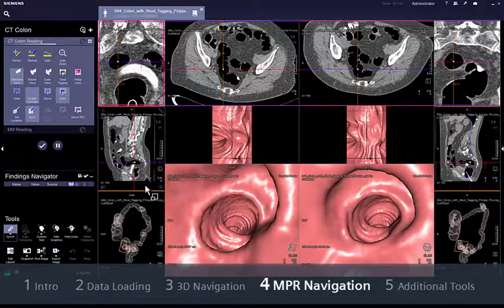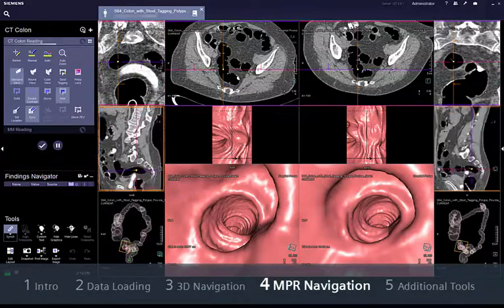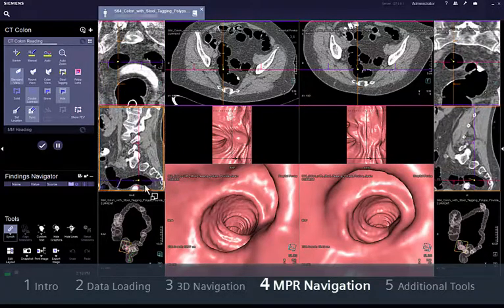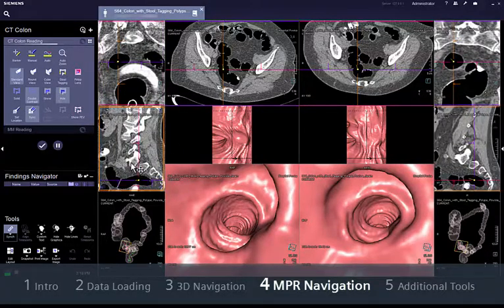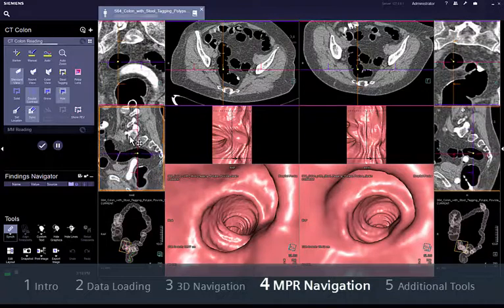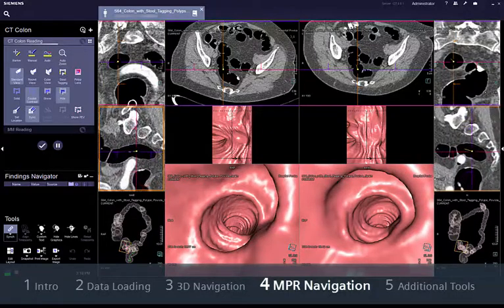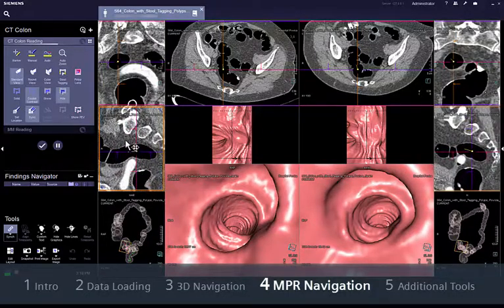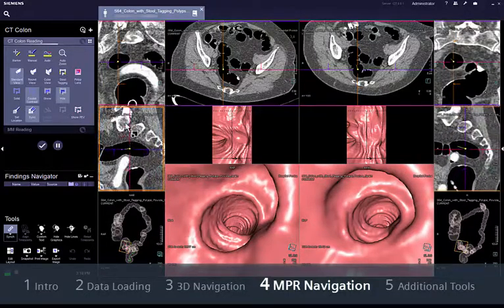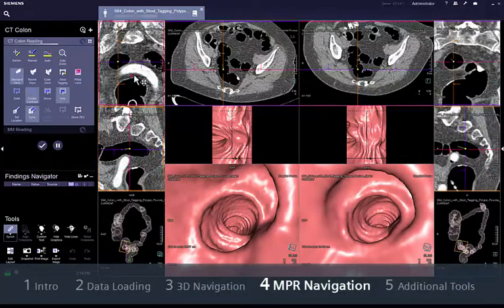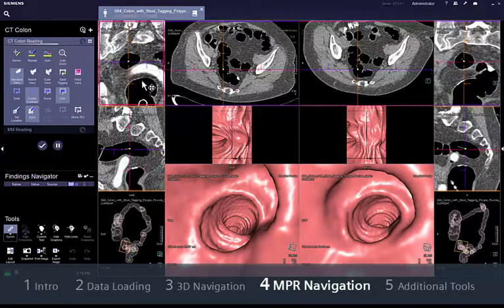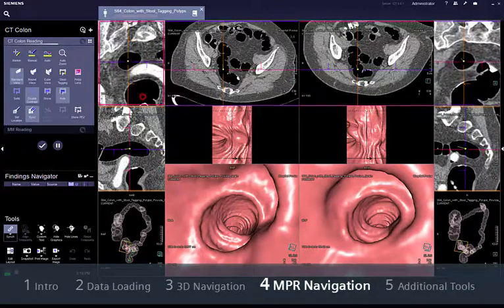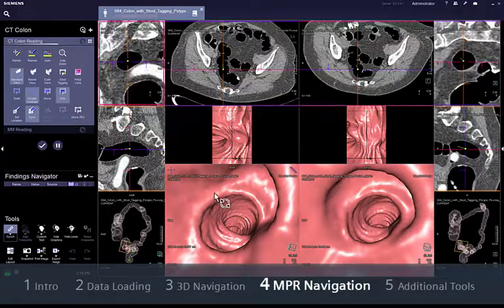Notice how the cursor changes its shape to show which function is active. If you are a 3D reader, you might find it useful to zoom the NPRs to display the lumen of the colon always at the position of the virtual endoscope, even during navigation.